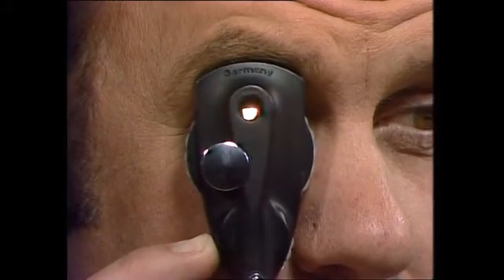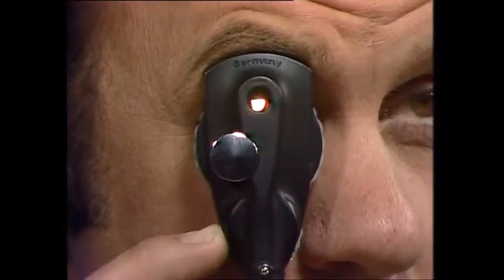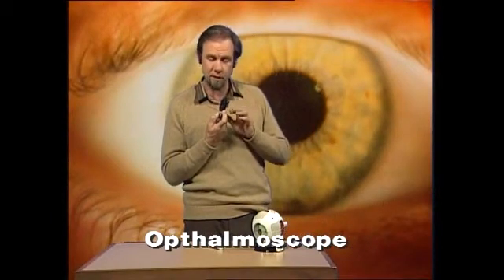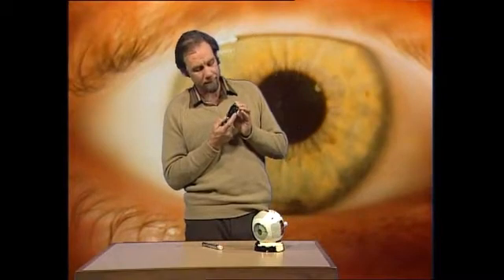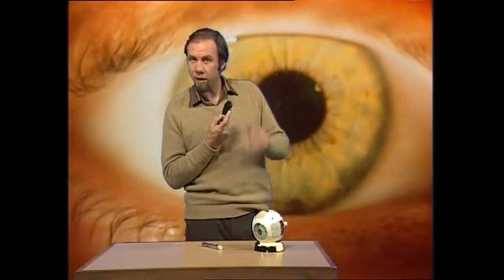Ever had your eyes tested? When they use this sort of thing on you, it's not terribly exciting. All you get is an eye full of light, very blinding for you. It's interesting for the person on the other end, because this is an ophthalmoscope — a very interesting device for allowing a doctor to look inside your eyes. You've probably noticed that he wields a little lever here, or turns a little wheel, and the thing clicks round. Why does he do it?